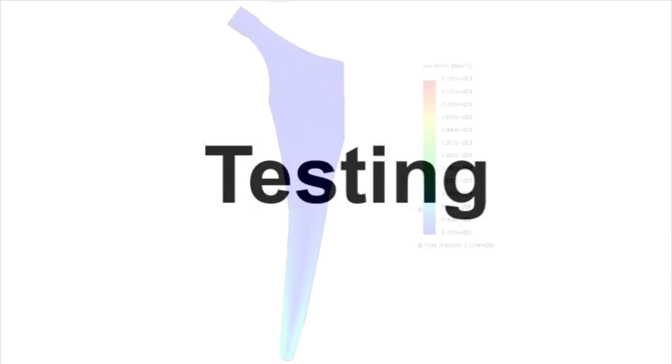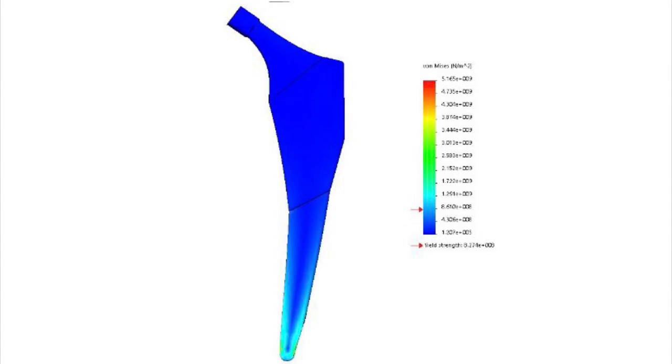In this part, I'll be talking about the testing and how I managed to get the results for my stem using FEA on SolidWorks. The results shown are for my static analysis using the FEA software on SolidWorks. From the results which I gathered, I managed to see that the stem that I created is not weak, it's strong in terms of it can bear the loading which I used, which again is 2000 newtons, and it doesn't seem to show any break points at all on the stem, which means it's a good stem to go ahead and do the pore structure.